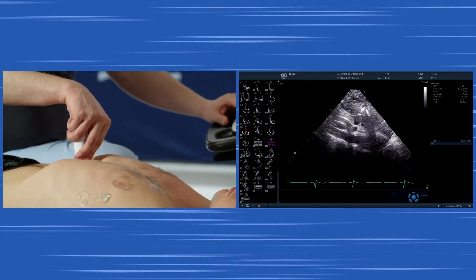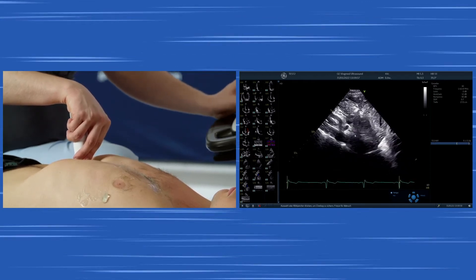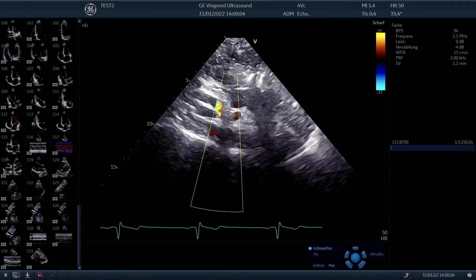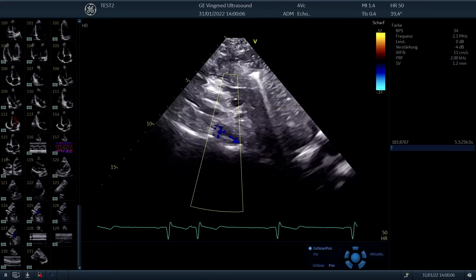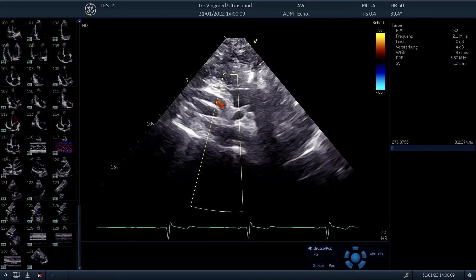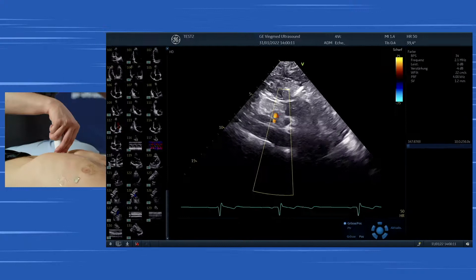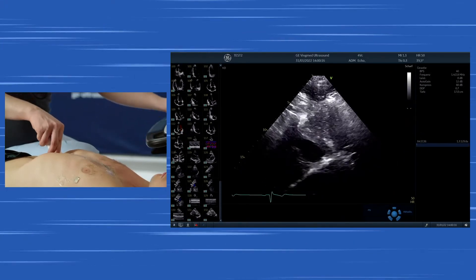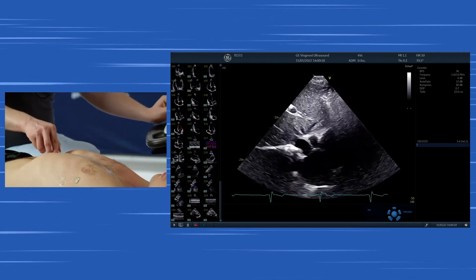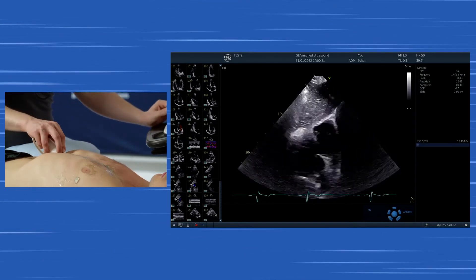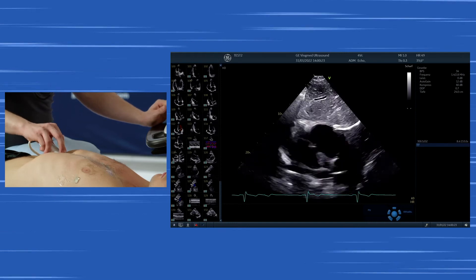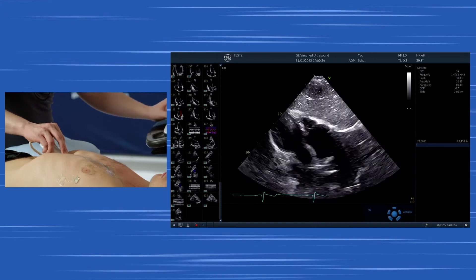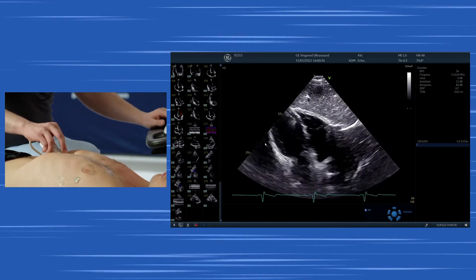If you then move the transducer towards the other side — not a rotation — from the IVC, which is located on the right side of the body, towards the aorta, we can visualize the superior mesenteric artery and the celiac trunk as well from a subcostal approach. Always keep in mind to adjust the depth so you are optimally positioned, and then try to rotate the transducer even more. You then have a view which almost looks like a parasternal long axis view.